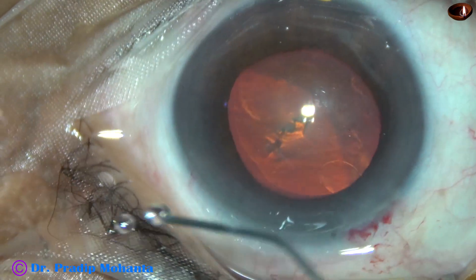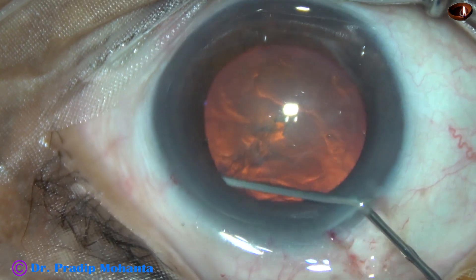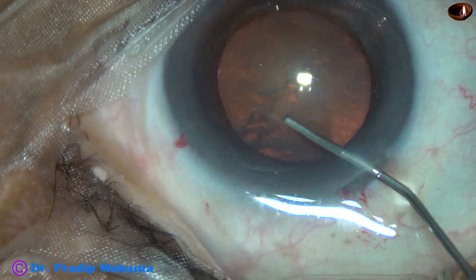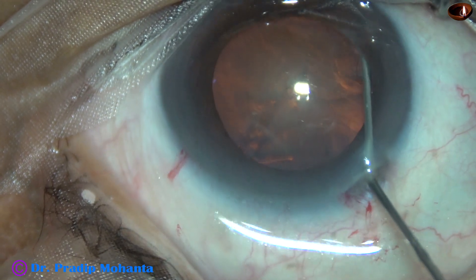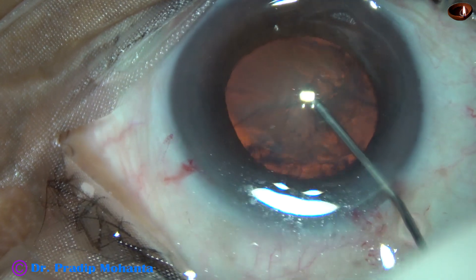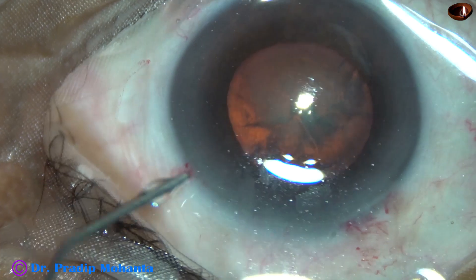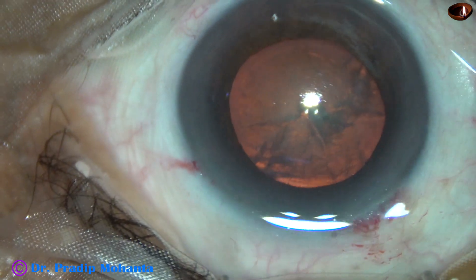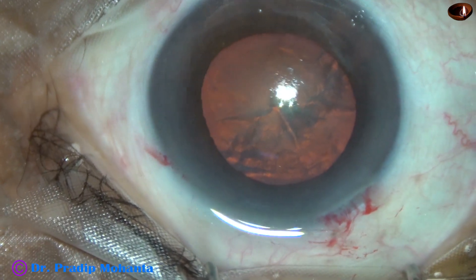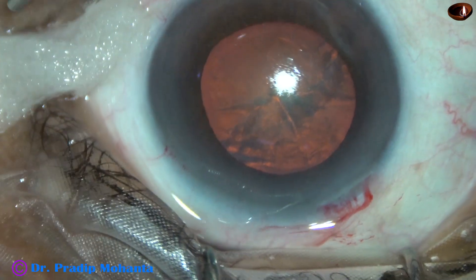Hydrodissection is now being done. Some amount of viscoelastic should be expressed out, and then with the help of a 27 gauge cannula, BSS is injected just under the anterior capsular rim and the fluid wave is observed. The nucleus is tapped and then mobilized. At this moment there is fluid collection on the ocular surface because the eye is deep-seated, and I have made a wick to drain the fluid.